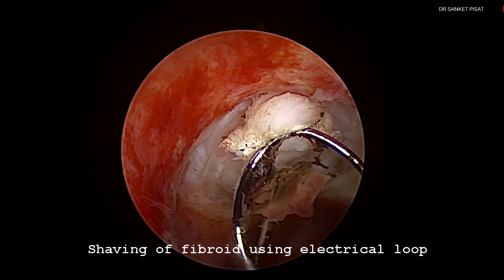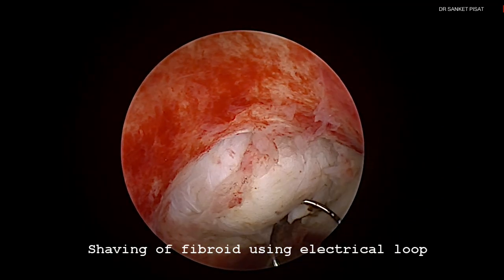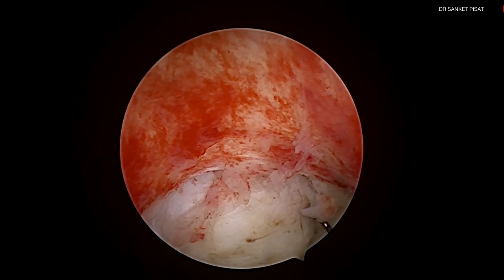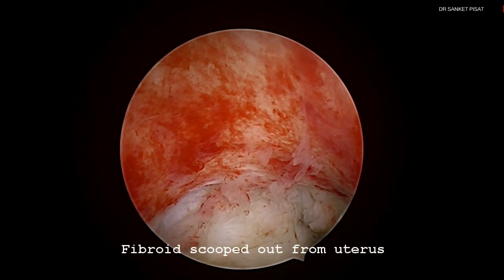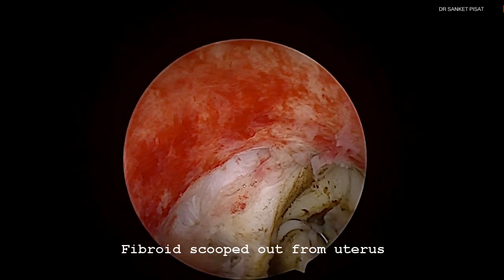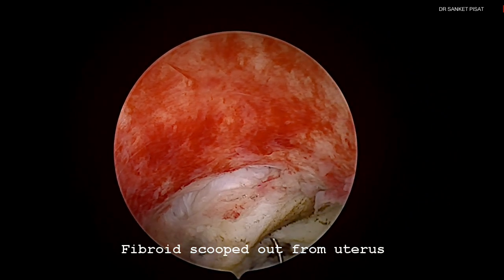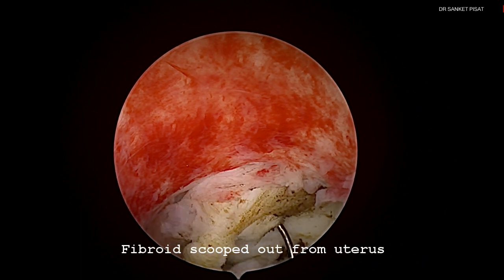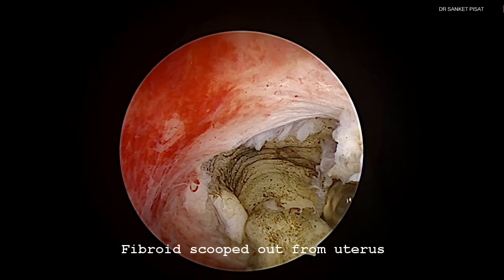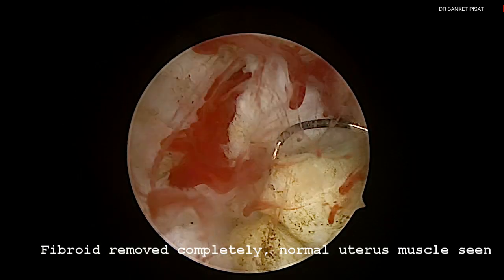Using an electrical loop the fibroid is first being slowly separated from its attachment to the surrounding normal musculature, and once that is done the fibroid is scooped out from its attachment site using the electrical cautery. Small pieces of the fibroid are made and detached gradually until such time that the normal uterine musculature is seen. These small bits are removed from the uterus after surgery and from time to time to make visualization of the end point of surgery easier.